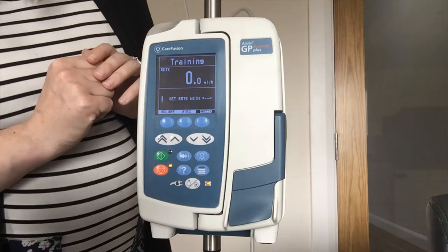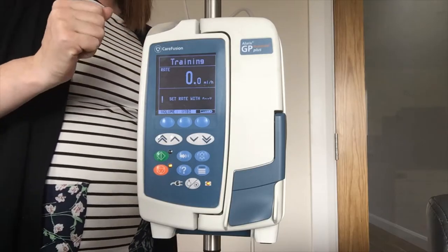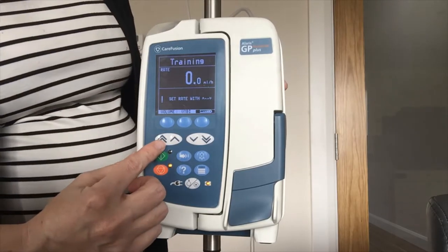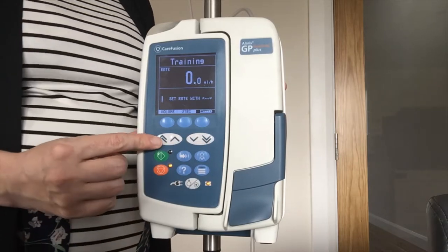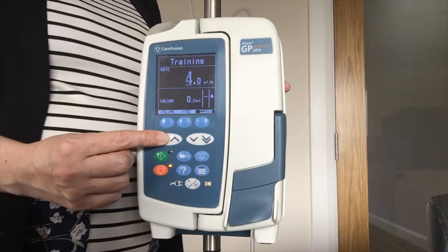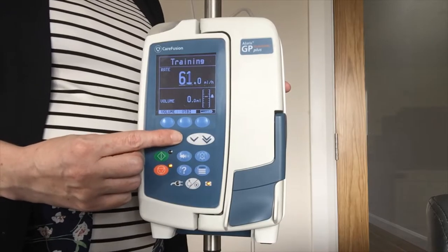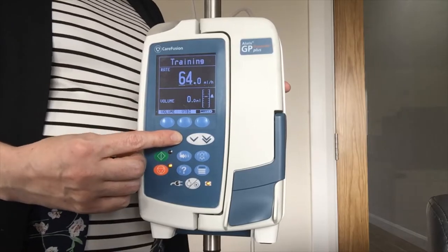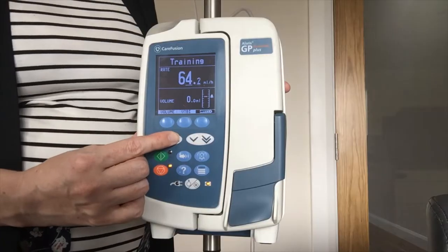On screen it is telling me to set the rate. Using my arrows up and down I am going to adjust the rate. I have a double arrow going up and a single, a double arrow going down and a single — the double is quicker than the single. Holding the double arrow it will go in increments for the first 10 and then jump in 10s after that. I have the single for 1, 2, 3 etc. And if I want a very accurate infusion I can move across to do 0.1, 0.2 etc.